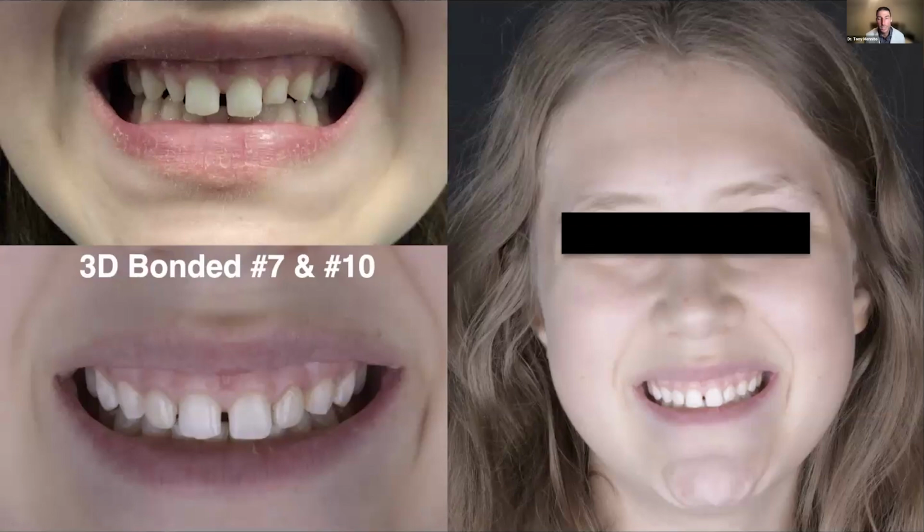Love it. And all this takes is a delivery appointment, right? I mean, it's not like a chairside veneer where you have to sculpt it. All the designing is done without the patient in the chair. They just come in and you deliver and it's done. So efficient. You've nailed it. And at our visit, when we're talking about things like this, it's almost a completely assistant-driven appointment.